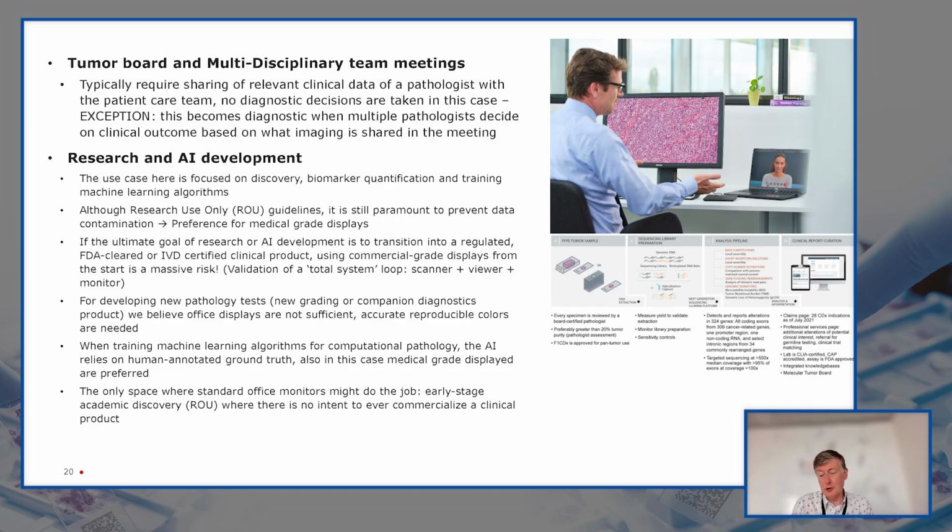And if you do that with multiple people, you better have the same experience, you better use the same displays, and medical grade displays are also the best choice there. The only space where you could use standard office monitors might be in early stage academic discovery for research use only, where there's no intent to ever commercialize to a clinical product. That's for AI and research.